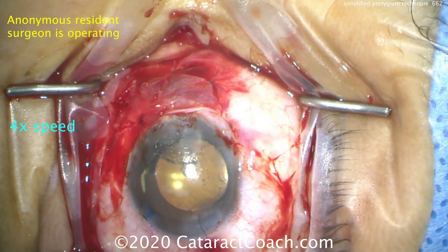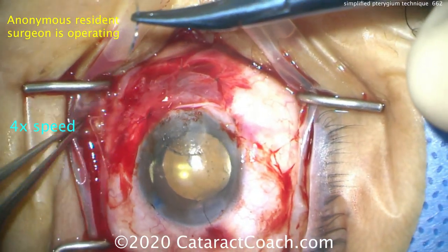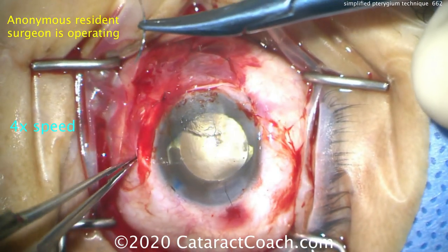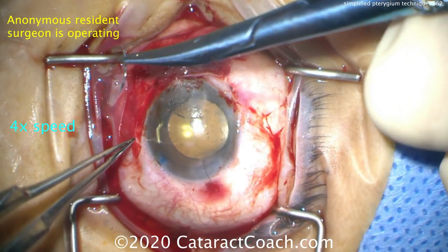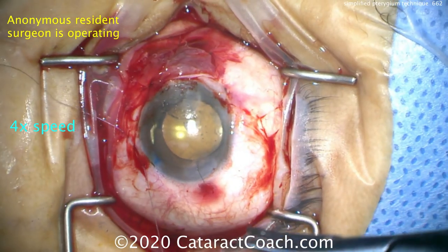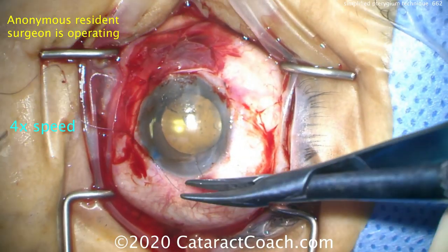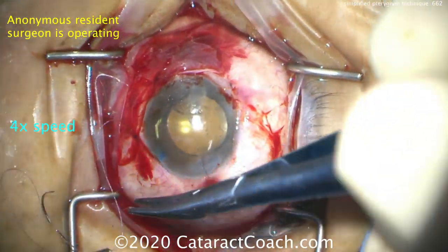This patient did beautifully. Simplified technique — what are the important points? One: inject lido with epi inside the lesion, inside the pterygium, before you're prepped — give the epi 10 minutes to work. Number two: dissect the tunnel underneath it. Number three: place the back end of a cotton tip in order to apply traction. Number four: use the crescent blade to carefully dissect that plane while the cotton tip's holding tension.